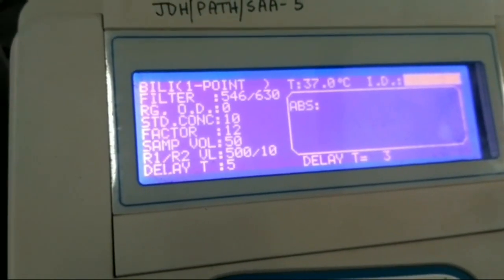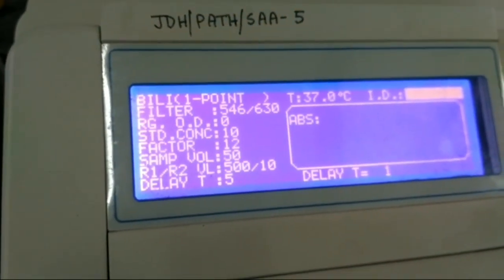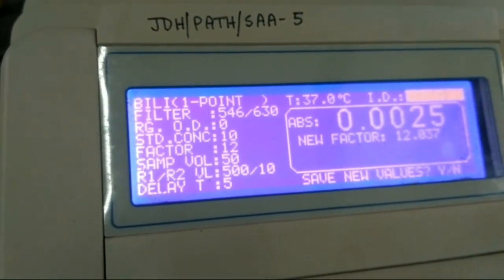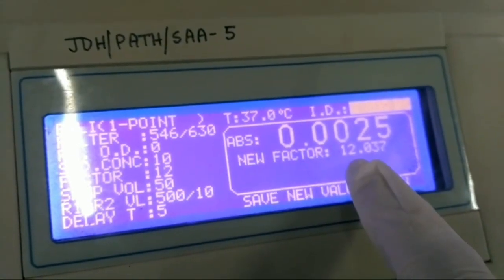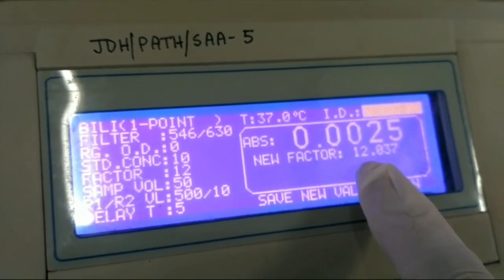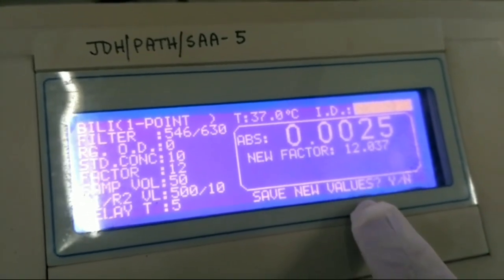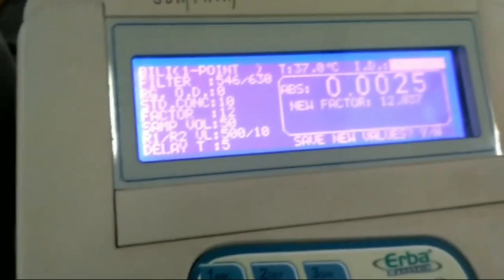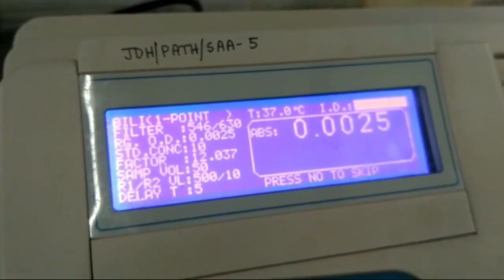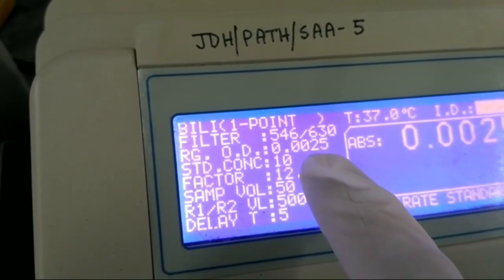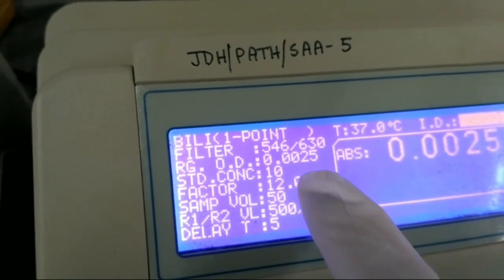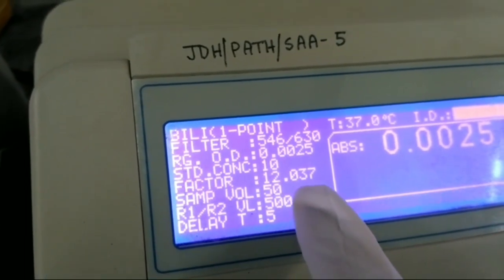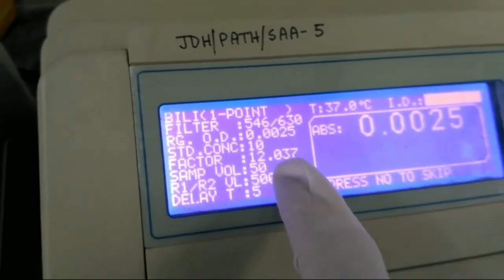In that case, a factor will be generated. The new factor is 12.037. We have to save it. When you save it, the reagent OD is also generated — the reagent OD is 0.0025 and the new factor is 12.037. Now the program is ready to measure bilirubin in any sample.